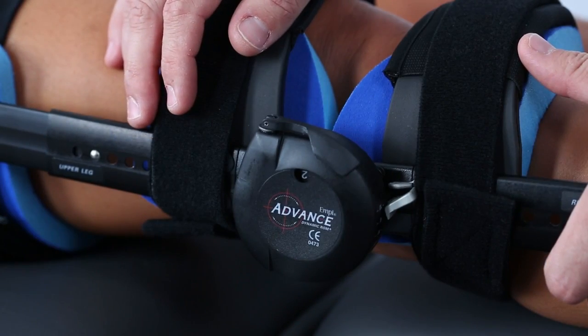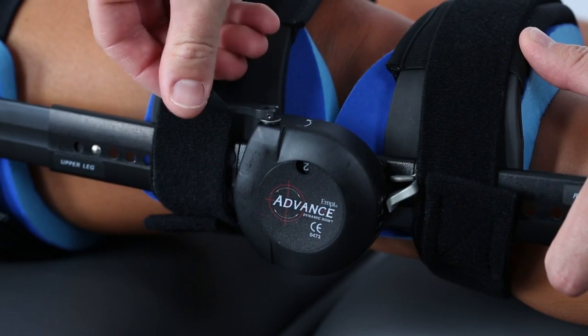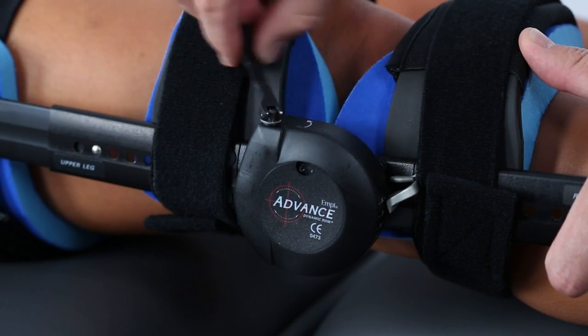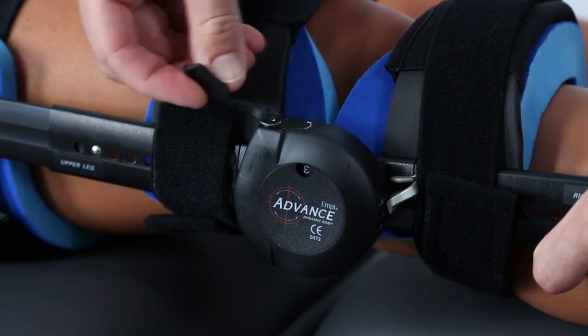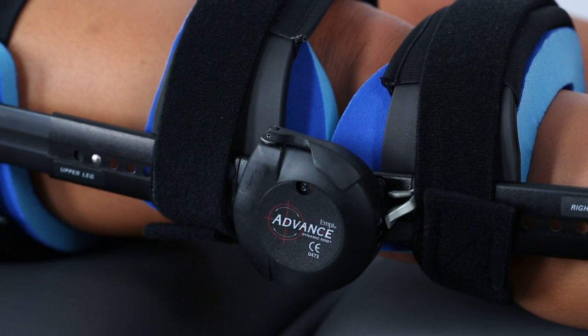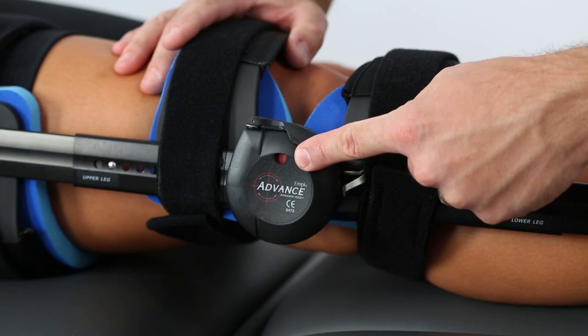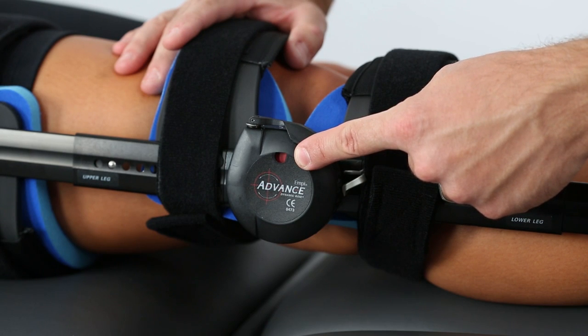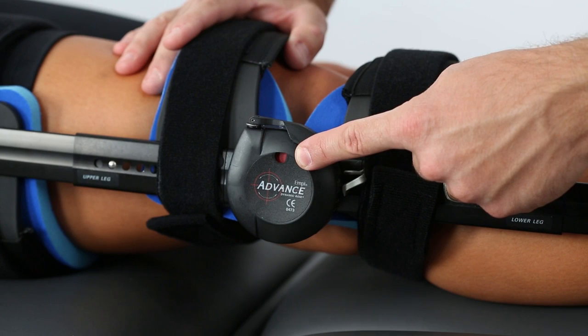To increase or decrease the torque, flip the tension control lever away from the tension spring cover and turn the lever in the desired direction. It's very important not to over-tighten or over-loosen the tension spring. Either action can damage the mechanism. A solid red bar in the tension indicator window before 0 or after 10 is a warning signal that you've turned the lever too far in either direction.